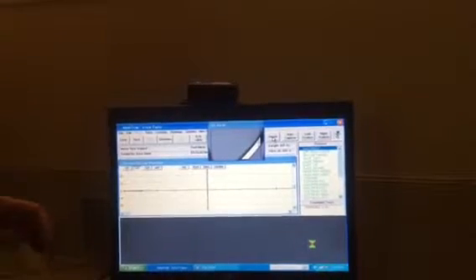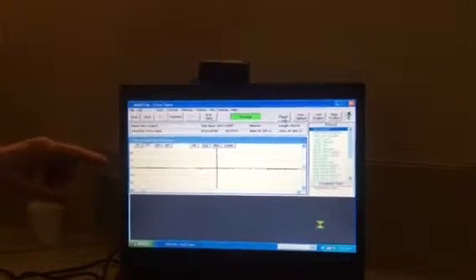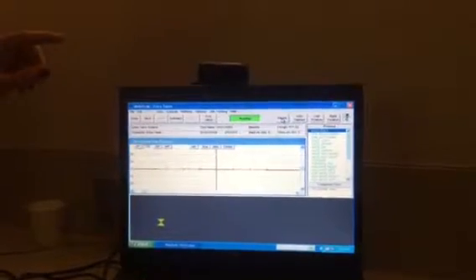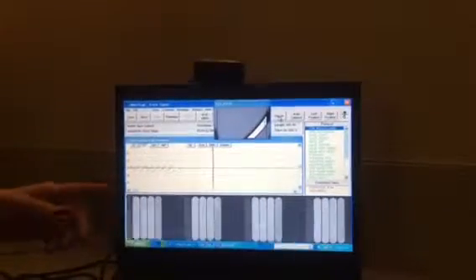Next test is the saccades. This is more difficult to see. What they're doing is they're looking to the left, holding it, looking to the right, holding it. When you've done the test for at least 25 seconds, then the test will appear on the bottom. I'm going to stop it at 15 and let's see if it goes. Okay, you took it. Anyway, here is the next test.